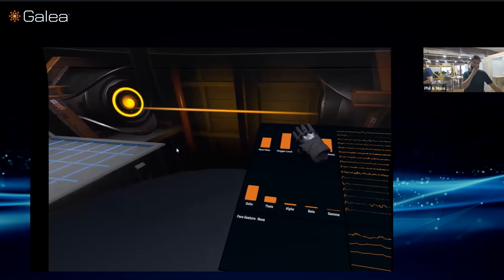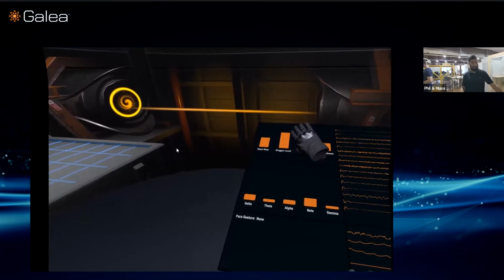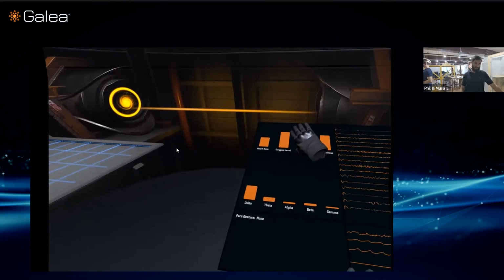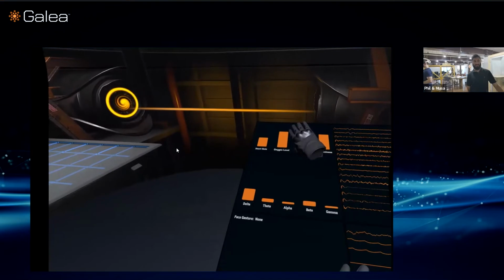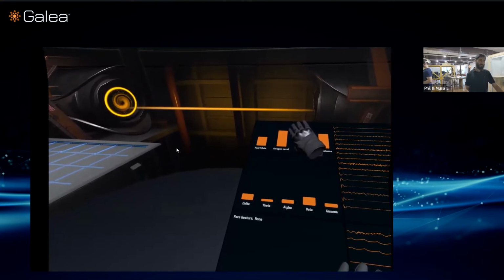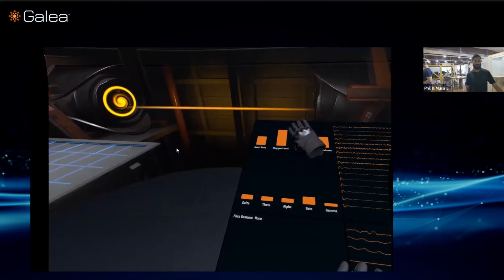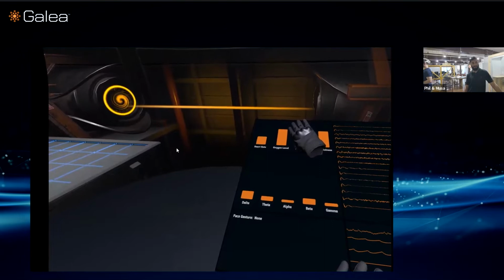And obviously, you can also see that when you're holding your breath, your heart rate is also suppressed because you don't have as much oxygen. So your body has to sort of cool down its metabolism because it knows that there's a lack of oxygen supply in the bloodstream. And when he finally stops holding his breath, you will see both the oxygen level and the heart rate recover pretty rapidly. Right now his heart rate is sitting at around 50 or 55.